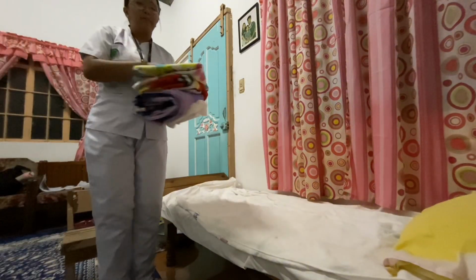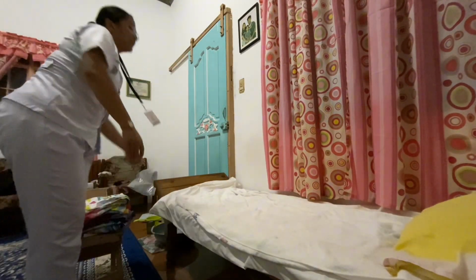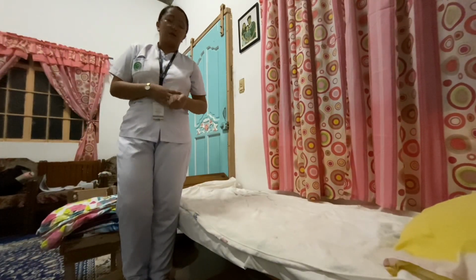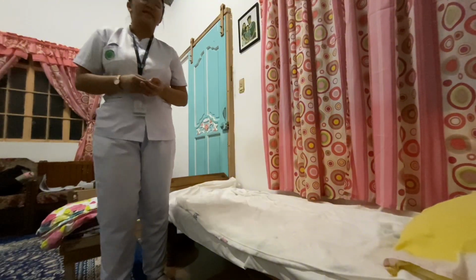So I've already prepared all the equipment needed, which is the clean linens that will be used later on, and I've put them over the table. I've also prepared a clean pair of gloves and also alcohol. So now I'm going to perform my hand hygiene and put on PPE as indicated to prevent the spread of microorganisms.